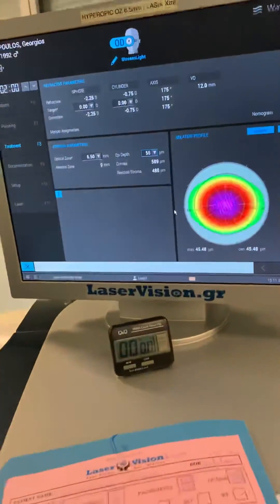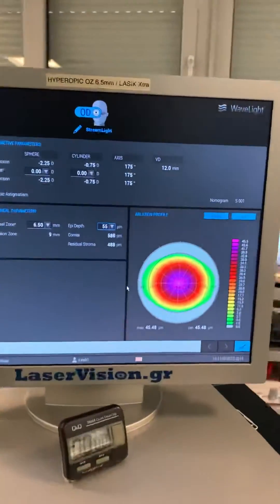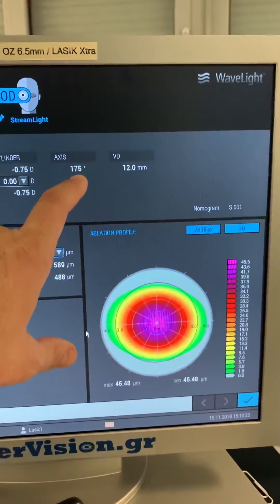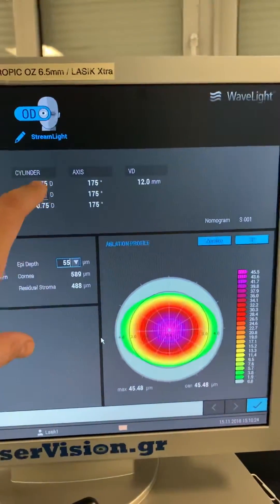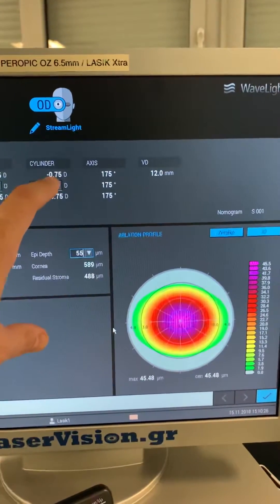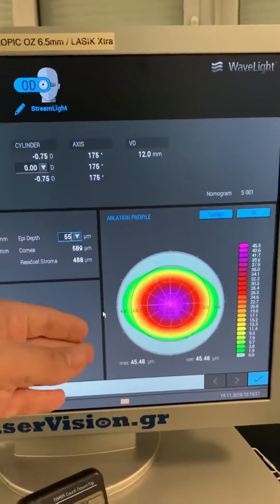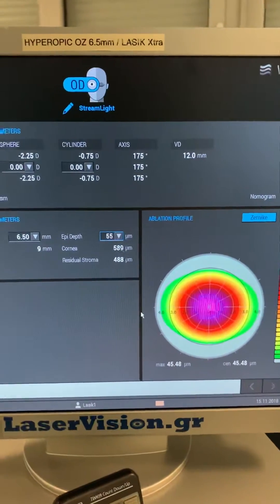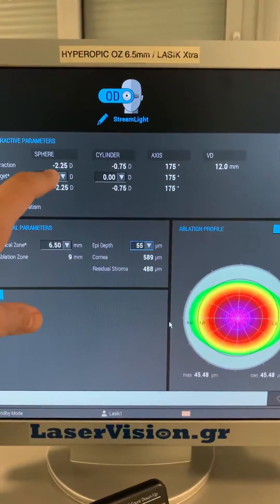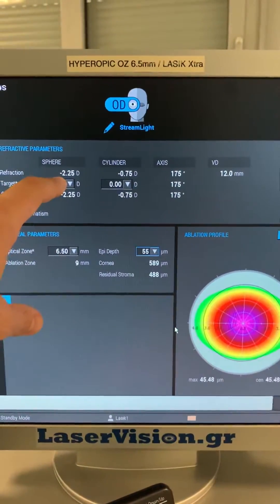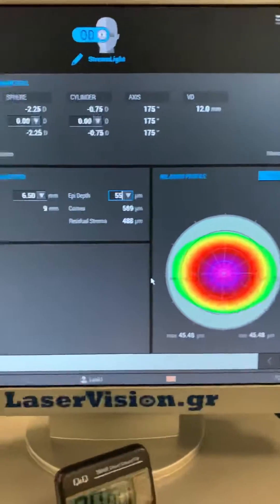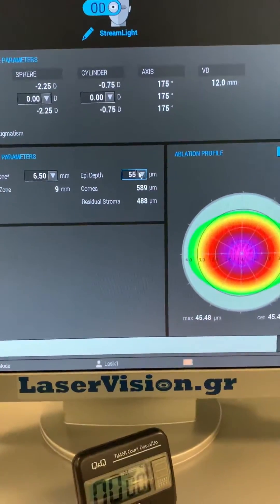Going directly to our treatment platform, what we did is we switched his cylinder axis from 172 to 175. We kept the 0.75 cylinder because this is with-the-rule astigmatism, and a 0.5 with-the-rule is something we can live with. We're leaving his spherical refraction as is and adjusting the Streamlight measurement to 55 microns.